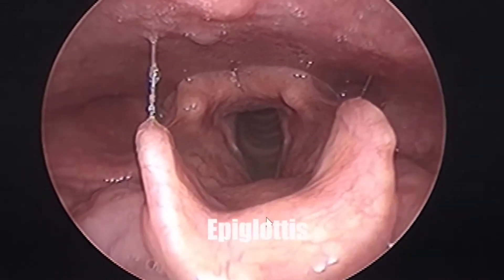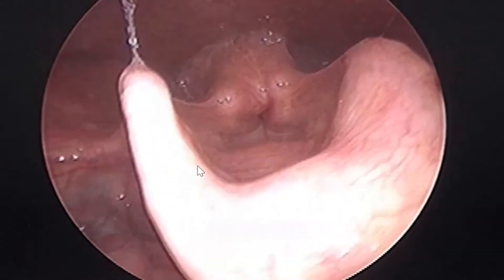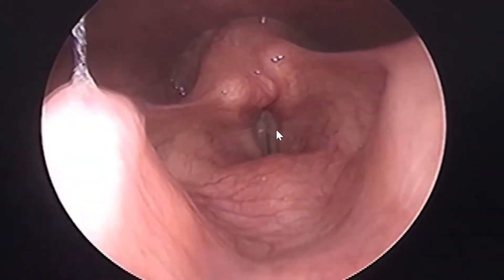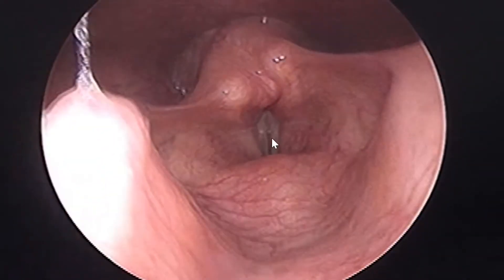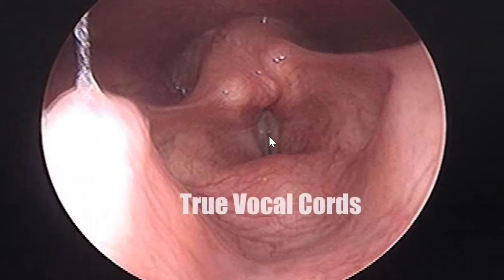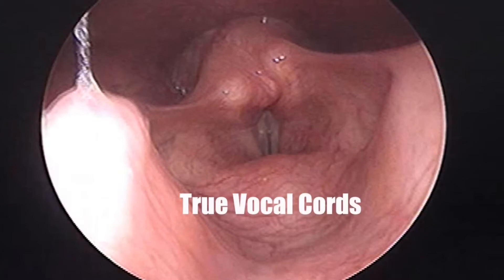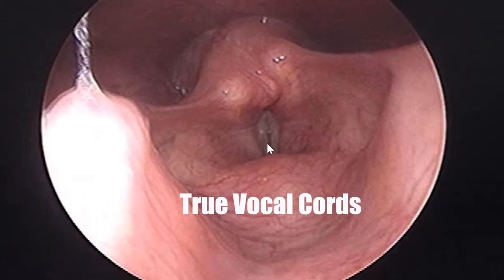You can see the epiglottis. Now the vocal cords are closed — these are the vocal cords, which are pearly white and clear. There is a slight vocal gap which you can appreciate as the vocal cords try to close fully.